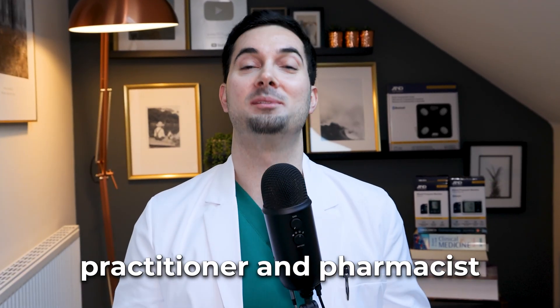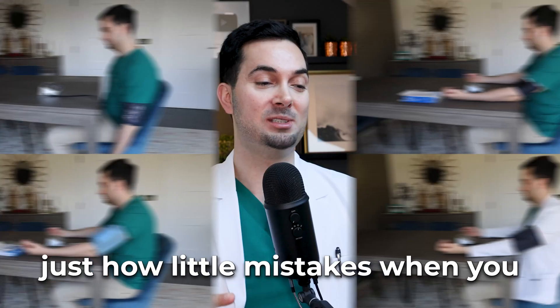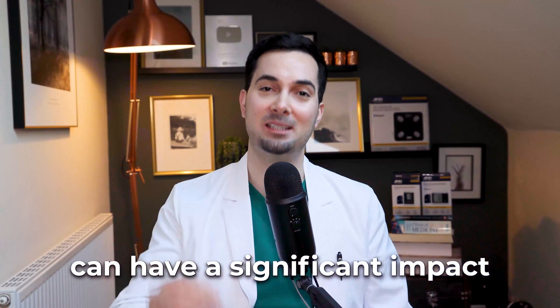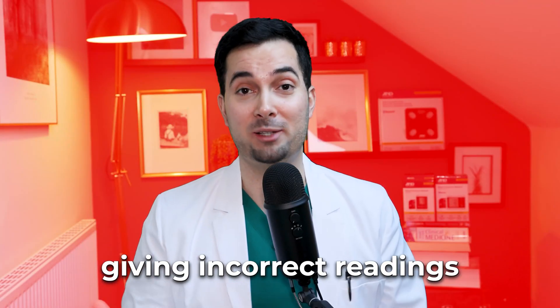As an advanced medical practitioner pharmacist practicing in family medicine, I've seen firsthand just how little mistakes when you take your blood pressure readings can have a significant impact on your blood pressure readings, giving incorrect readings. So in this video, we're going to conduct an experiment to see just how much making these simple mistakes can affect your blood pressure.